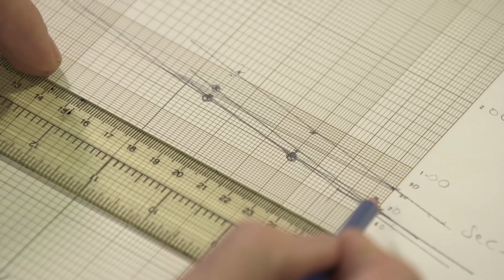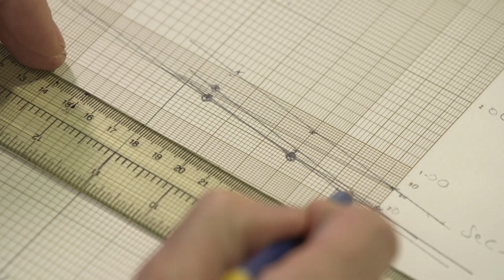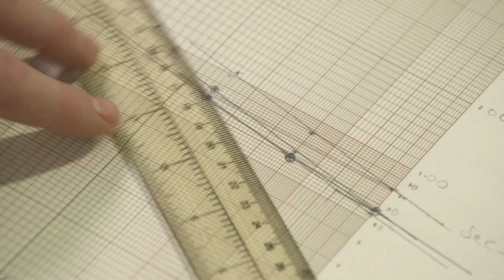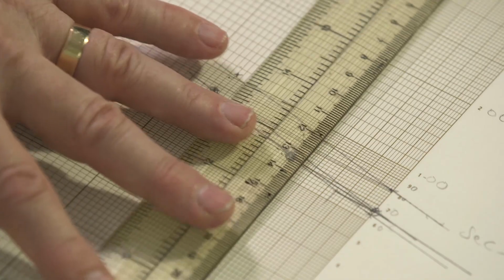If we only had that point and we looked on the standard line, what is the concentration of standard that would plot at 67 seconds? The answer would have been around 74%. 74% of 94, 69.6, 70 international units per deciliter. We would have underestimated the real factor VIII by about 30%, by about 24 international units per deciliter. That's an important inaccuracy.